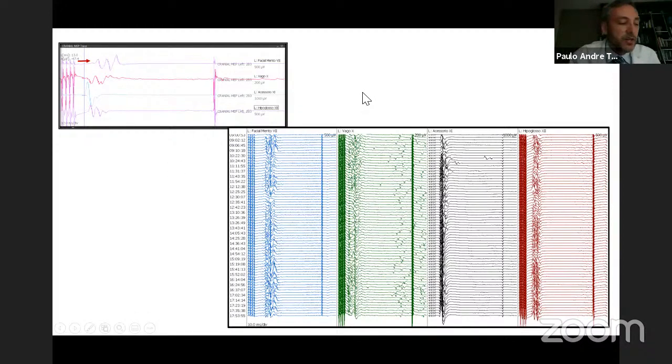This slide is just to show you that we can trust the technique, because this patient already had surgery in the past, and the outcome was a slight facial palsy. During the clinical evaluation, we can see the patient has a facial palsy. So the latency is prolonged compared to the other nerves, like hypoglossal, accessory, and vagus. Latencies are much shorter than the facial nerve and should be almost the same, a little bit longer for the other bulbar nerves than for the facial. The response should be here, and it is prolonged here, maybe because of the facial palsy. And we can see this is consistent also for the facial, vagus, accessory, and hypoglossal nerves.